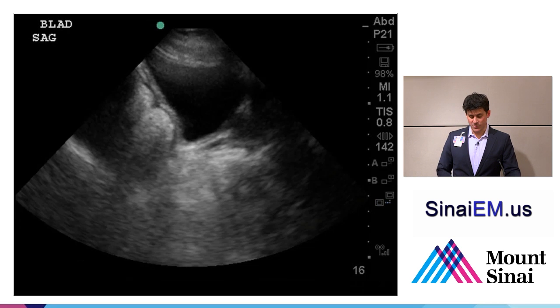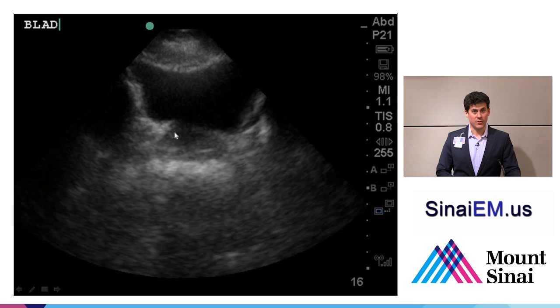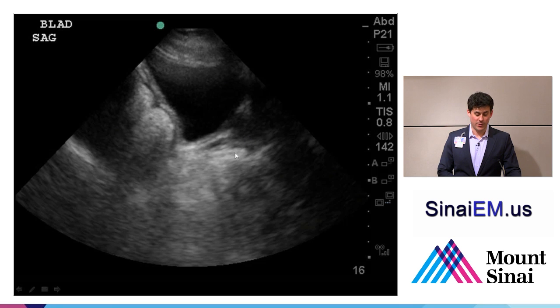In a transverse view of the bladder, it takes on a trapezoidal or square shape depending on how full it is. Behind it, we'll see the vaginal cuff, uterus, or prostate depending on the patient's sex. In a sagittal orientation, we see a more triangular-shaped bladder with bowel above and behind it. Occasionally, like in this patient, you can see a bit of prostate, or in a female, the uterus coming up behind the bladder.